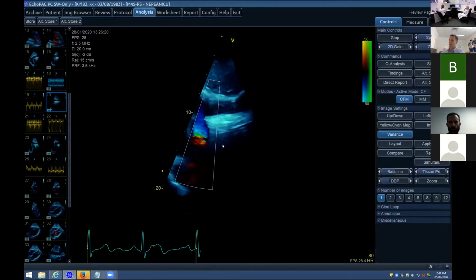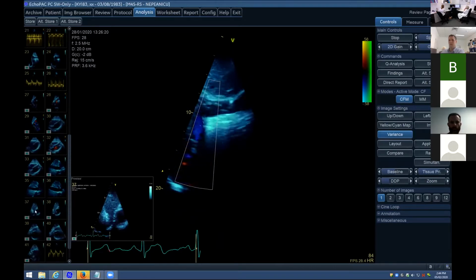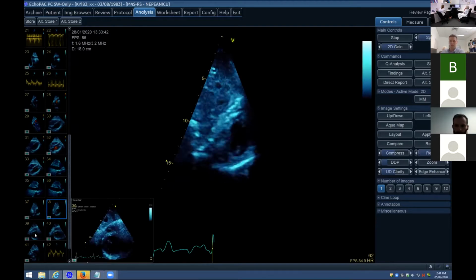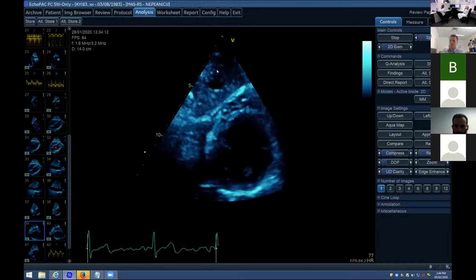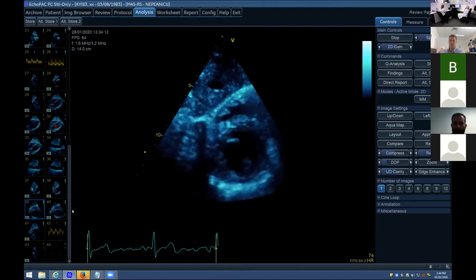And then I guess what's probably easier to try is some of the other imaging. If you just rotate the probe 90 degrees, you can get your short axis view from your subcostal views. And here's our LV at the mitral valve level with our RV on top. And here's imaging through the liver, trying to get a short axis view. So particularly looking for regional wall motion and things like that, it's really useful.